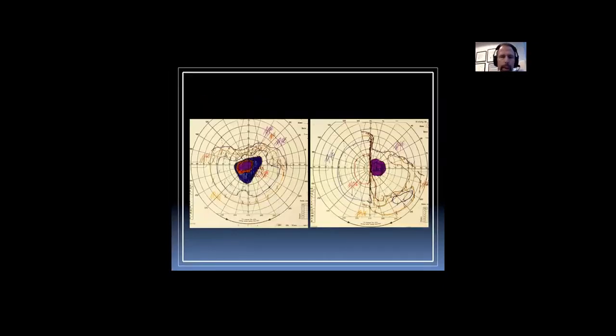So I know this is a little bit tougher because it's a Goldmann visual field, and in general, at least my residents are not used to looking at Goldmann visual fields. But if we look at this, I think one of the tricks to looking at Goldmann visual fields is look at the smallest isopter first. So the smallest isopter is going to be, in this case, just this little red bit here.